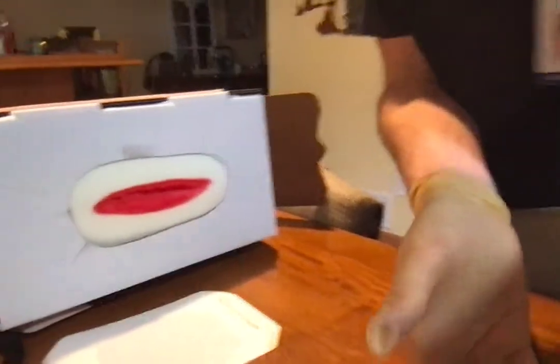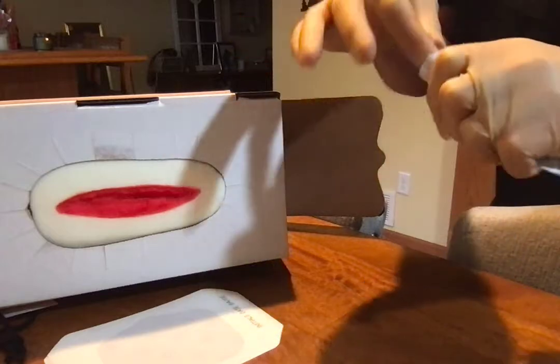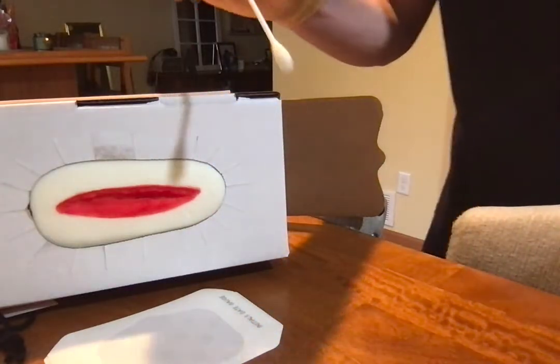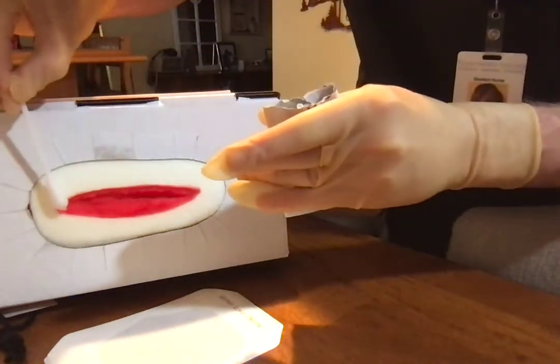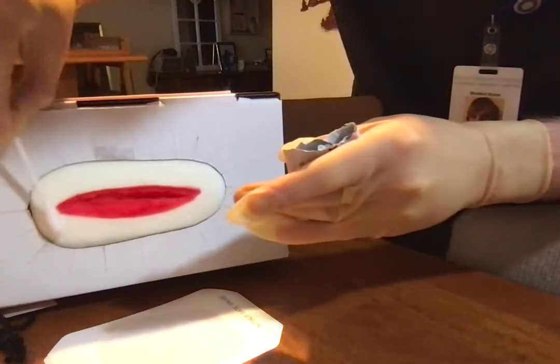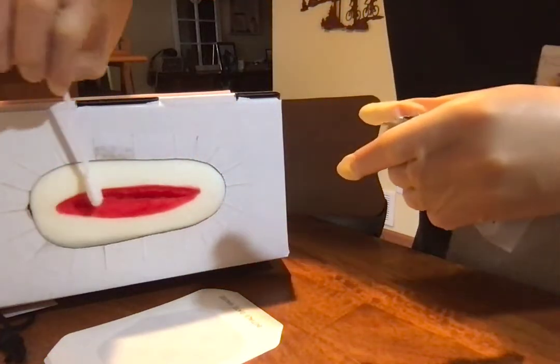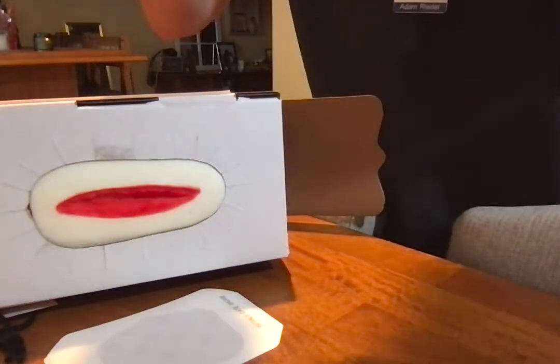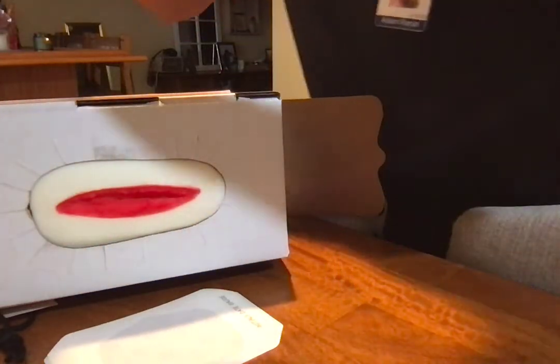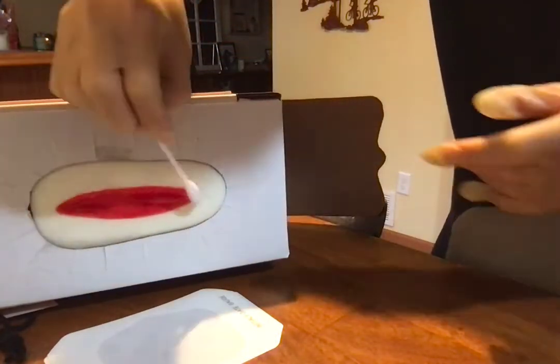Alright, I'm going to non-sterilely move the camera here. And then I would use these swab sticks that I would have had in the kit and open. I wouldn't be using alcohol, so this would be a saline swab stick, and I'd be swabbing and cleaning the outside edges and throwing those into my biohazard bag. And noting any extra drainage or extra blood or any pain that would potentially be occurring when we were doing any of this dressing change care.